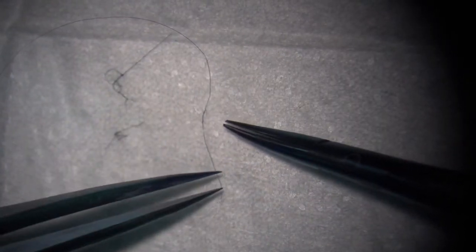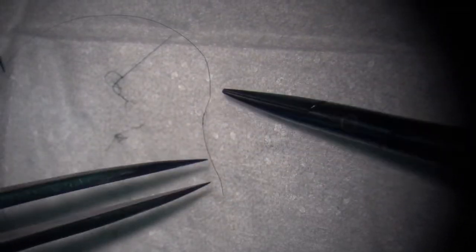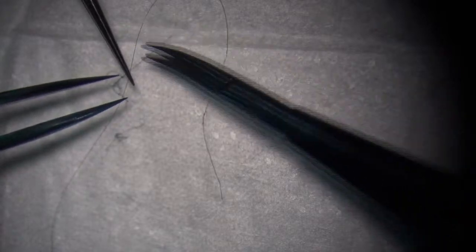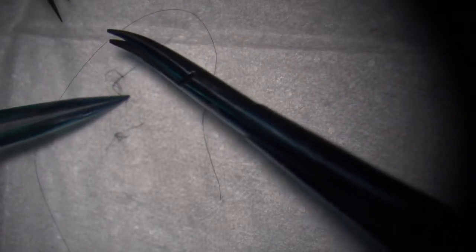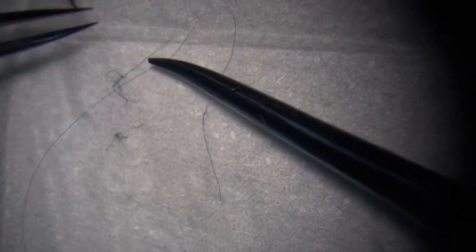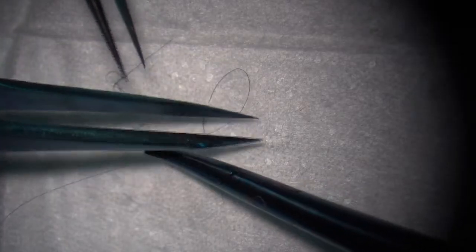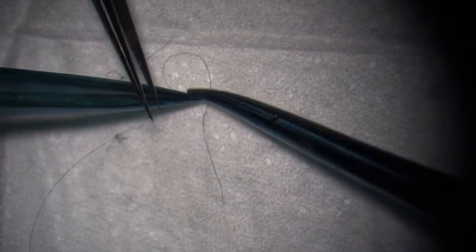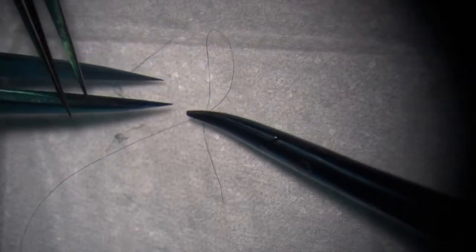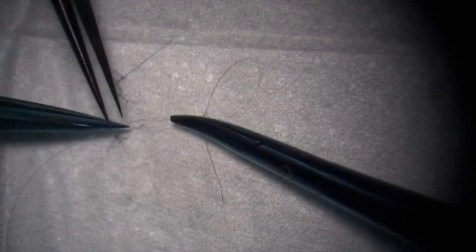So no, still holding the long end. Still hold the long end with here. And because the first knot we didn't recross the suture, so keep using this forceps holding the long end. Okay. Yeah, just keep going.